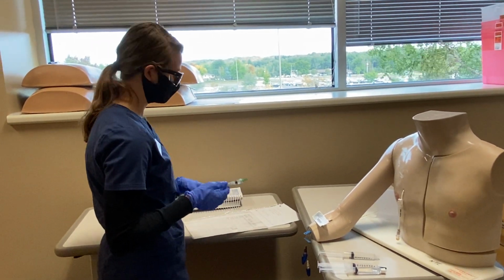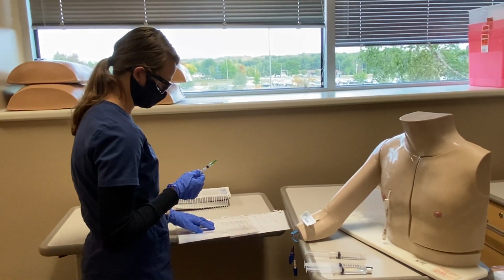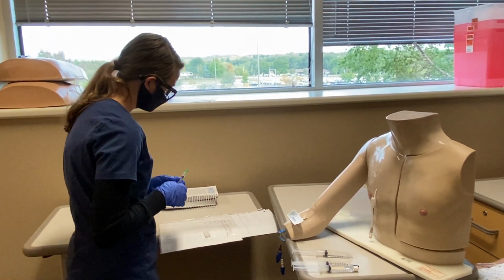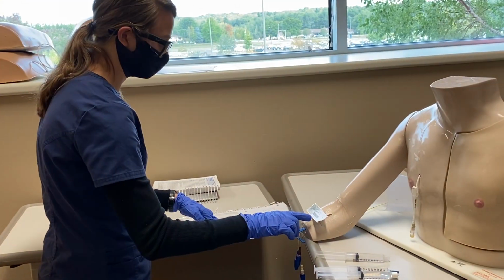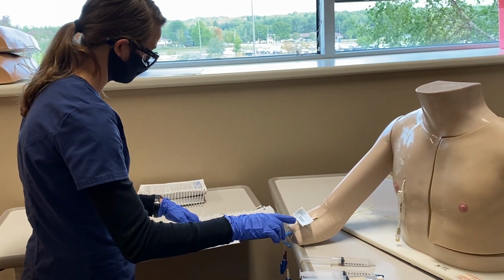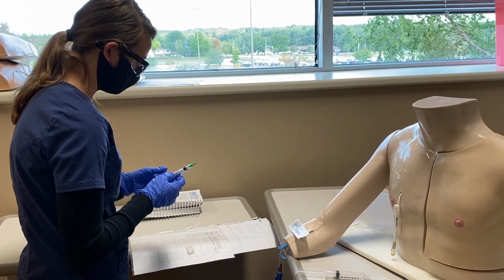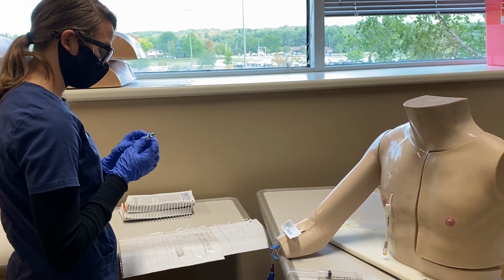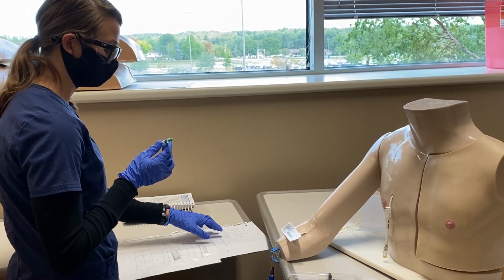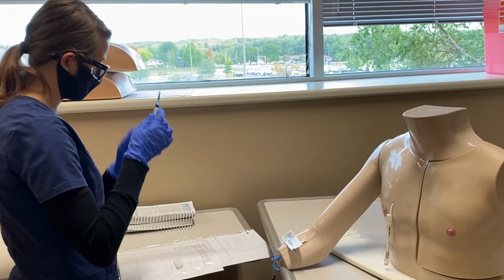And before administering this, I have my gloves on, I washed my hands, and I'm going to do my 5 checks 3 times. So I have Bob Owens, birthday 9/22/1933. He is allergic to morphine. I'm giving hydromorphone today. Ordered is 1 milligram. After calculating the math, I'm going to be giving 0.5 milliliters, which I have, 0.5 milliliters.